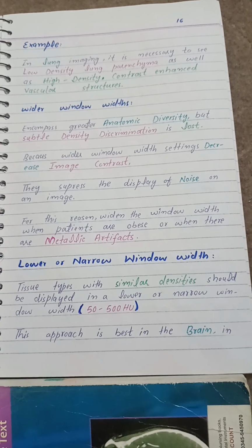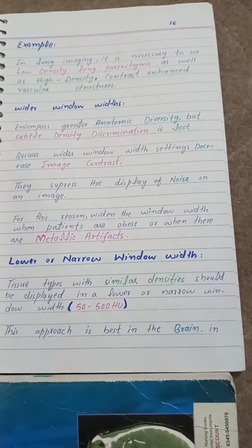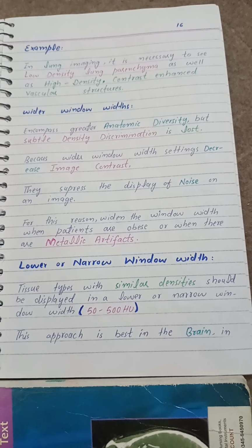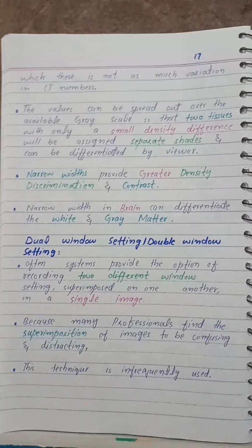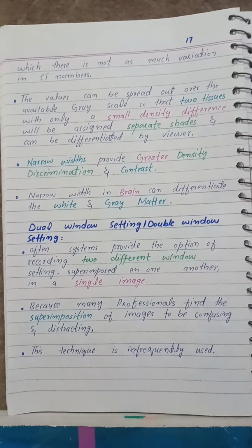Lower or narrow window width: tissue types with similar density should be displayed in a lower or narrow window width, 50 to 500 Hounsfield units. This approach is best in the brain, in which there is not as much variation in CT numbers.